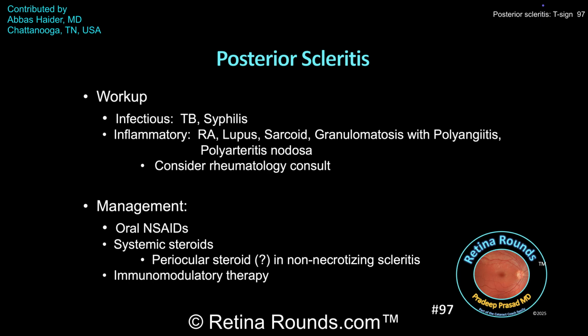This is a great demonstration of the ultrasonographic features of posterior scleritis, and we want to thank Dr. Haider again for his very helpful contribution.